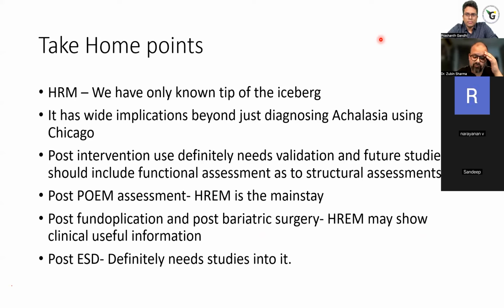Post-intervention, definitely, whatever I'm saying requires more validation. It requires good studies, but I think in India right now, the whole endoscopic ESD work or POEM work is directed towards structural changes or outcomes in the current studies. We are not really studying what happens to the motility or the functional part.